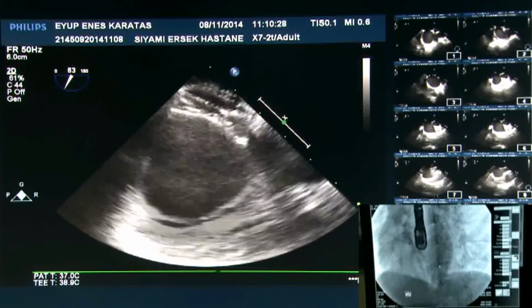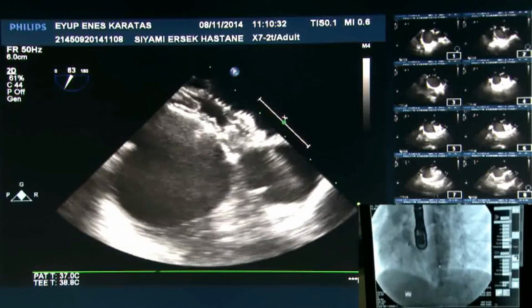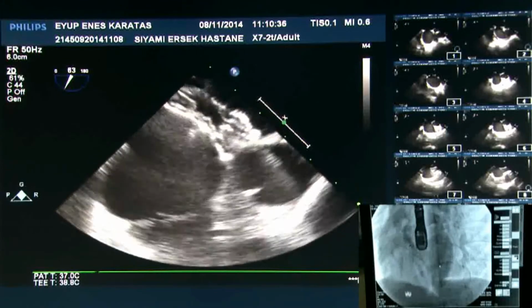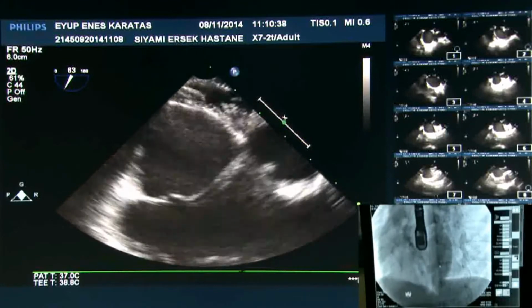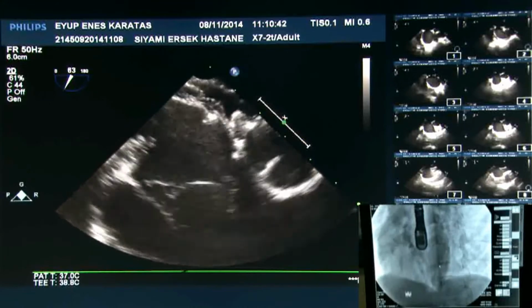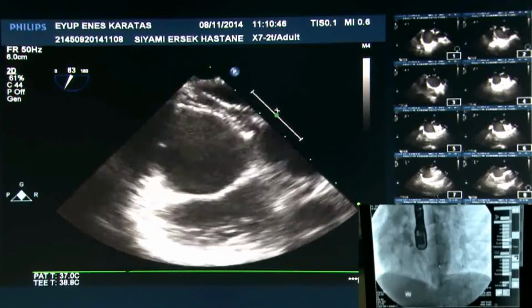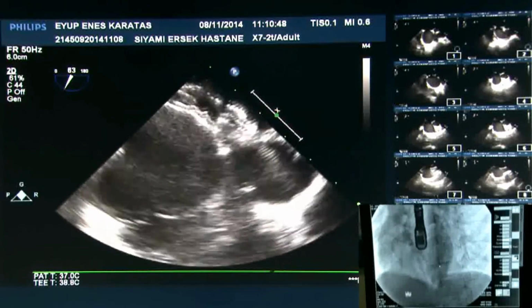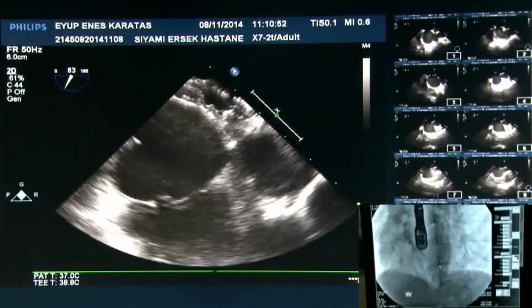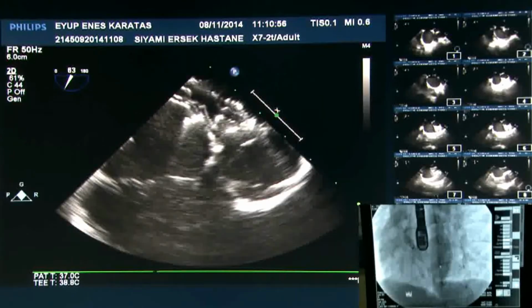And I was saying to Felix that in the last 5 years, the only embolization of a device I've had is where I balloon sized first. And Felix said that the only embolization he had was when he didn't balloon size. So that is really the scientific evidence we have. Well, how floppy was the rim in this case? Floppy or very floppy? Very, very floppy. So be careful about that.